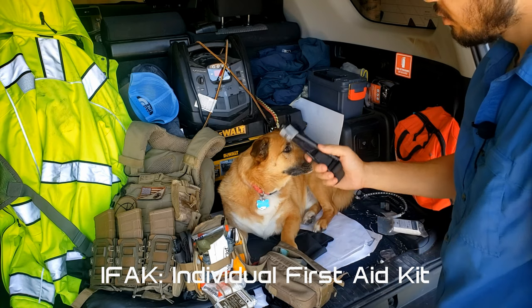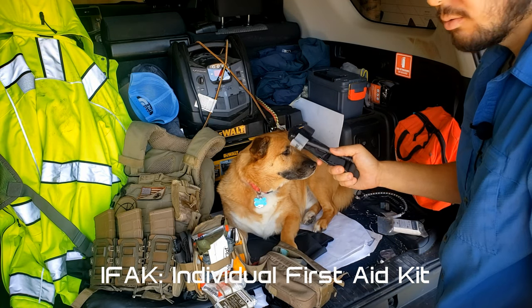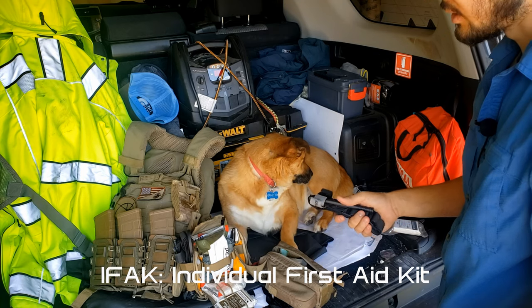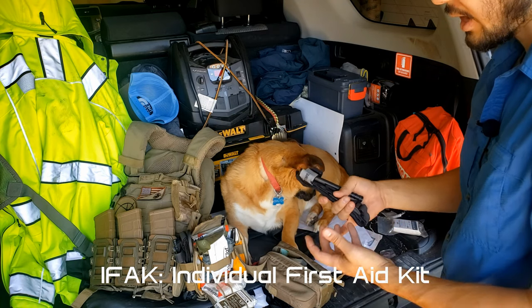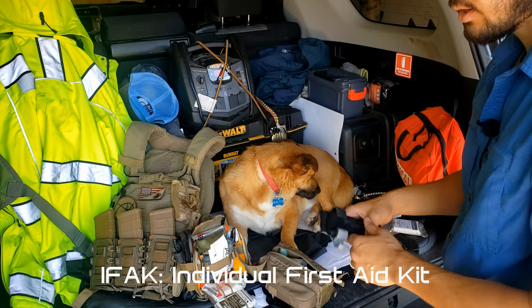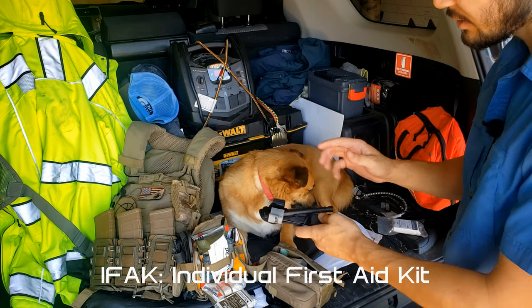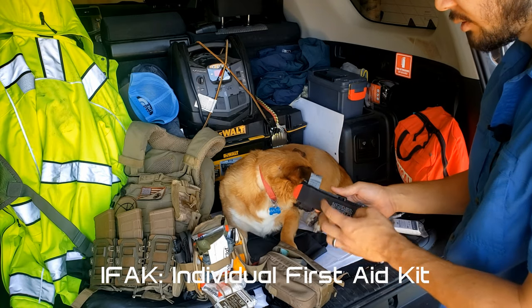Another thing, too: you always take it out of the packaging. You never keep it in the packaging. Think about it. It's an emergency, your mind's freaking out, your hands are covered in blood, and now you've got to try to open this plastic packaging and then stage the tourniquet, which nowadays they actually come pre-staged usually, which is pretty good. They used to not.